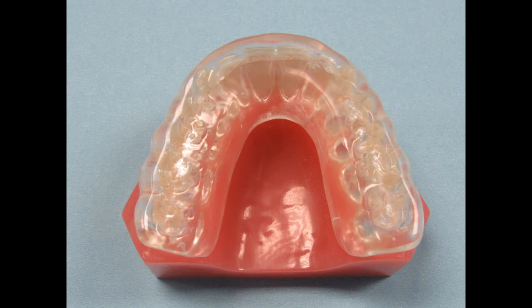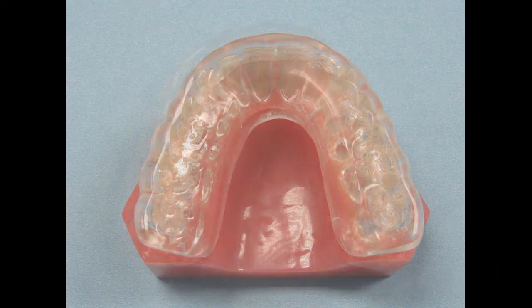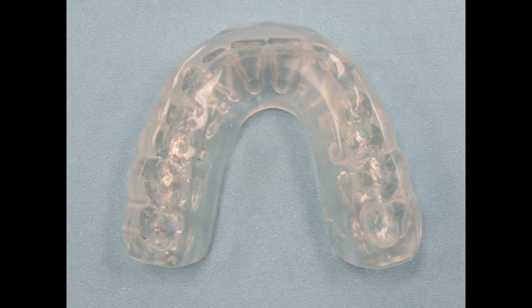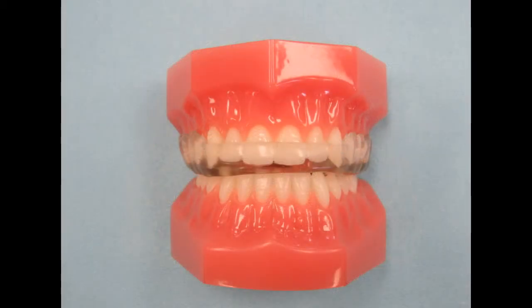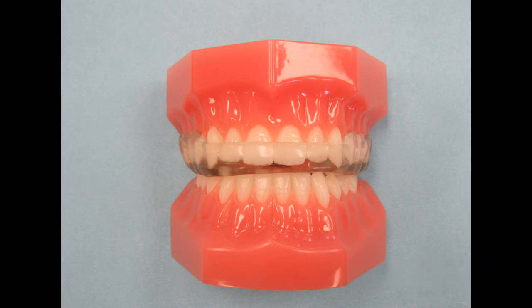A special night guard that we fabricate is the Talon night guard. It's made with a thermocryl inner shell and a hard acrylic outer shell. The patient heats the inner portion under hot tap water, which softens the acrylic to make it easier to insert. As the thermocryl inner shell cools down, it hardens to the same strength as the outer shell and locks into the undercuts. This process makes it very retentive without the need for clasps. The appliance can be worn on the upper or the lower arch, whichever you or the patient prefers. This night guard is thinner than the hard-soft night guard. The occlusal surface can have any depth of indents or no indents at all — please let us know how you would like us to finish it.